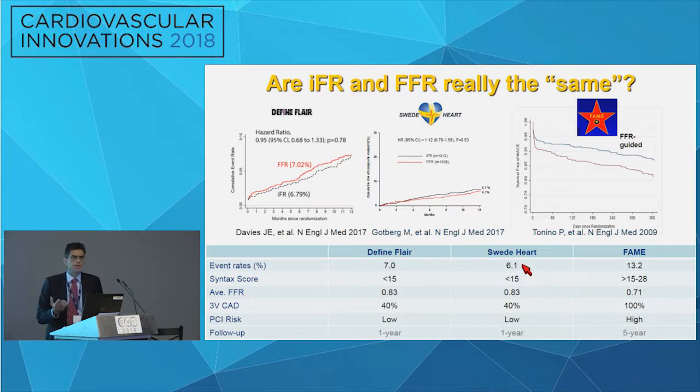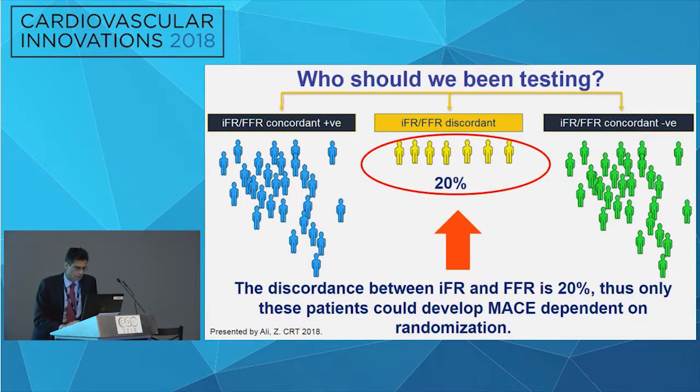So people are still thinking that for the high-risk patients, FFR might be the preferred way to go because it's validated and there is much more to gain. Do you believe that? So for the high-risk people, would you do FFR more? Okay, so more people are nodding.